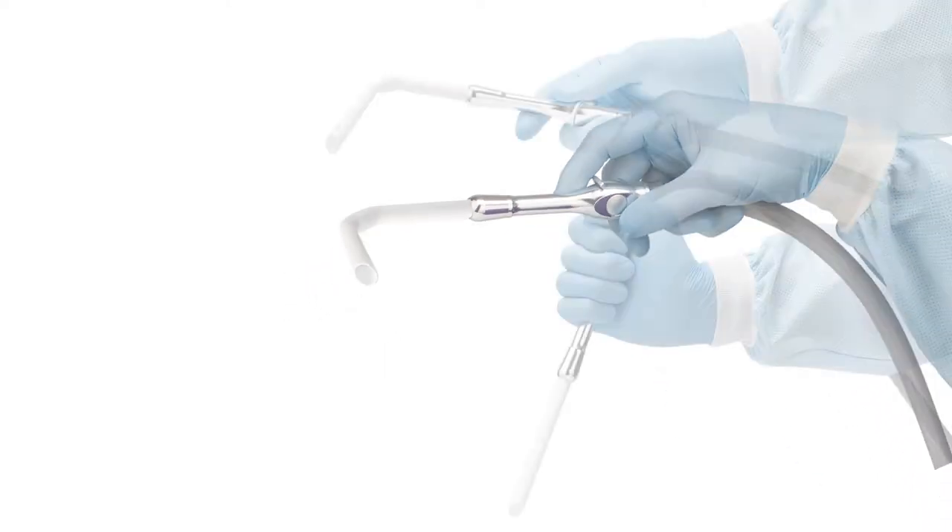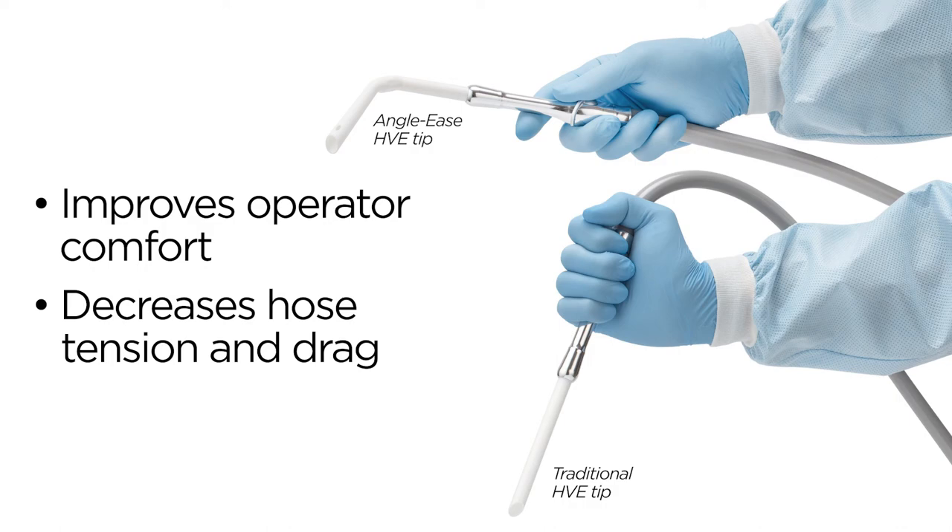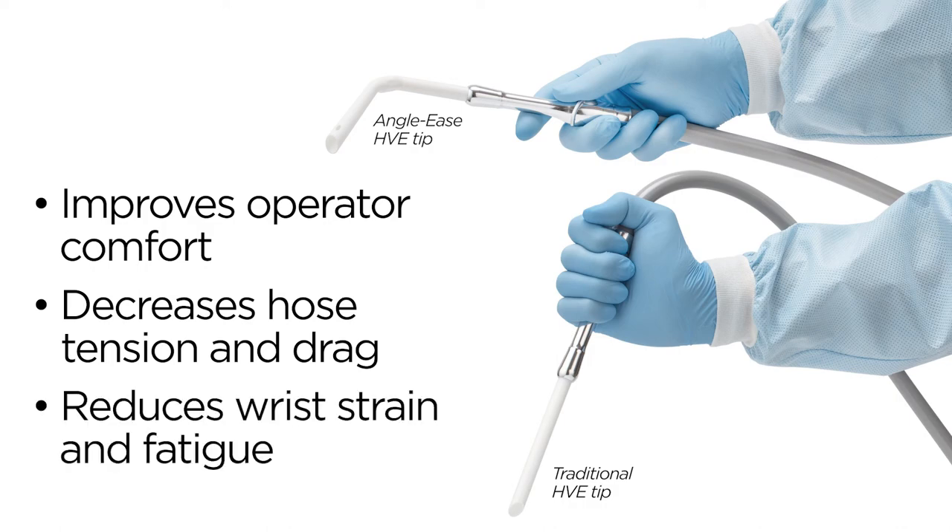This patented feature of Angolese improves operator comfort by decreasing hose tension and drag, which reduces strain and fatigue on the wrist.